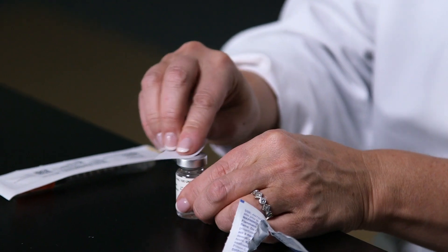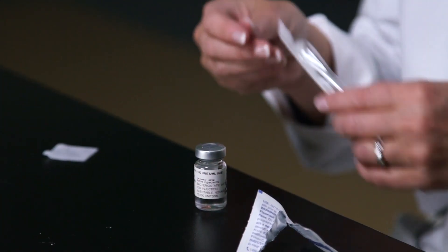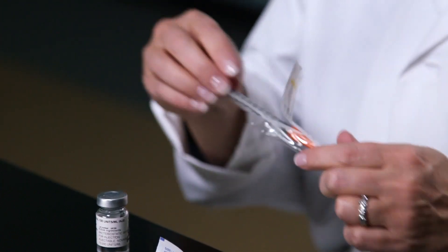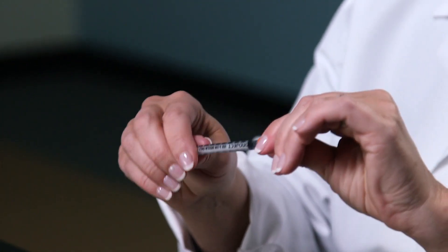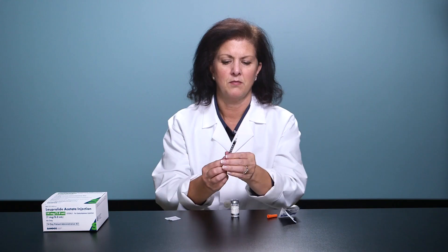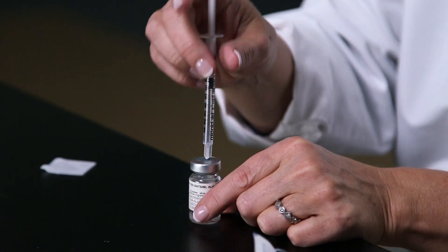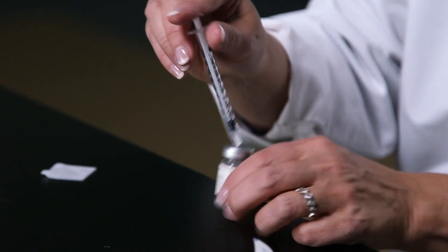You'll alcohol wipe the top of the vial rubber stopper. Use the correct syringes for your dose. Draw back to the dose that you've been prescribed. Insert the needle through the rubber stopper and inject the air.